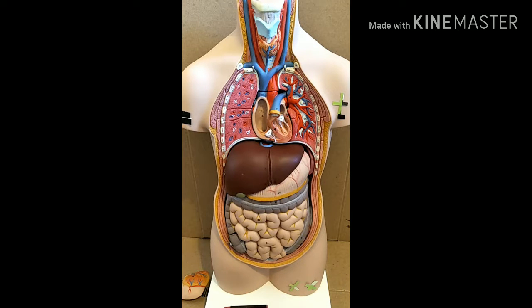Okay, in this case, I'm going to talk about why different leads record different patterns in terms of their waves, the degree of upward deflection and the degree of downward deflection. First thing, you have to recognize that different limb leads record the electrical activity of the heart at different angles. That means they view the electrical activity of the heart from different views because they are placed at different parts of the body.